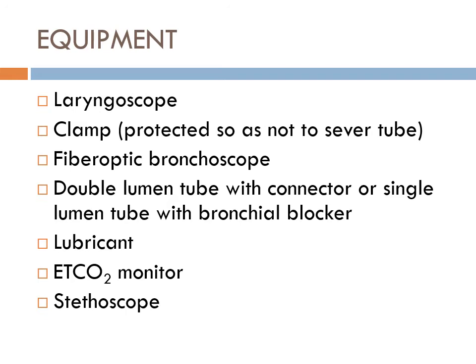So I put air in here, probably around 2 cc's of air. You try to keep it really low. So I inflate the right. What would I do with the left, or the blue in this case? Now remember, this could flip and turn the other way, and now it's the opposite, right? So you have to know what you're looking at. What do you do with the other one?